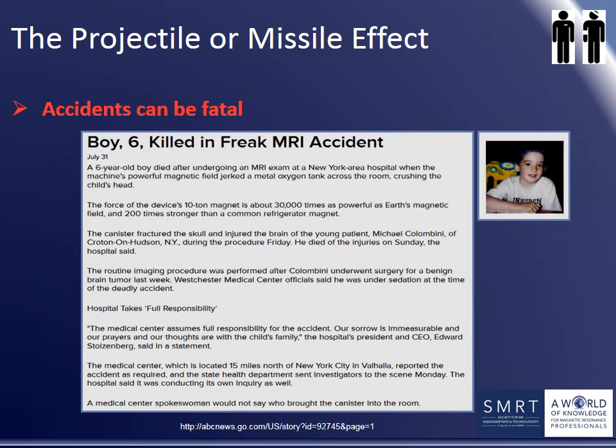Unfortunately, sometimes these accidents can be fatal. This was the case when a 6-year-old boy, Michael Colombini, was hit by an oxygen cylinder with a magnetizable casing during an MRI examination. Michael was having a routine scan under sedation, and before the exam began, the anesthesiologist observed a decline in his oxygen saturation levels. The MRI technologist was attending to some problems with the oxygen supply from the wall outlet when a ward nurse passing through the department heard the anesthesiologist's cry for help and handed him a portable oxygen cylinder near the door of the scanner room.